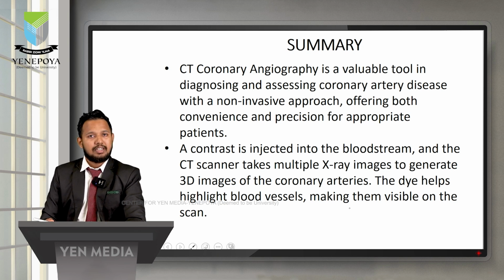So what happens is the dye will help to highlight the blood vessels, making them visible on the scan. And once the scan is done, we will be doing the post-processing and tracking each and every vessel which is seen in the CT coronary angiography. So once this is done, the CT angiography procedure will be done and the radiologist will report the scan.